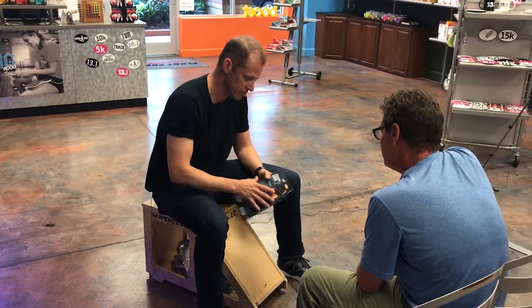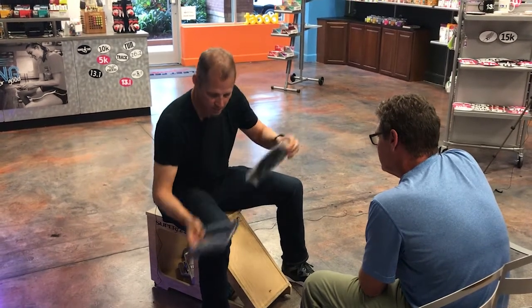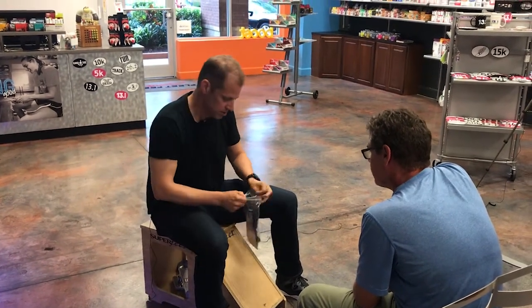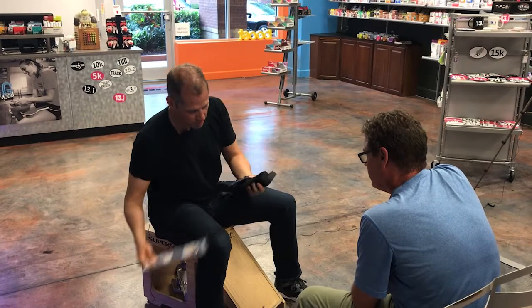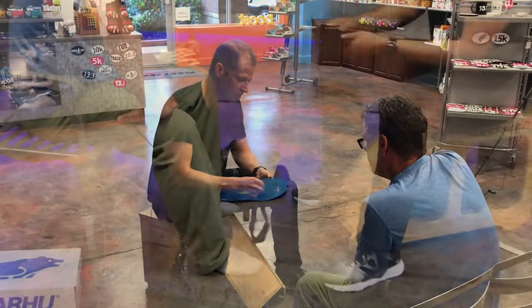So now I'm going to show you how to put the sock on so you get the best benefit from it. What you want to do is take it out of the package first. And you've got a couple of Velcro straps. One is on the toes and one is around the top of the sock that holds the sock up.